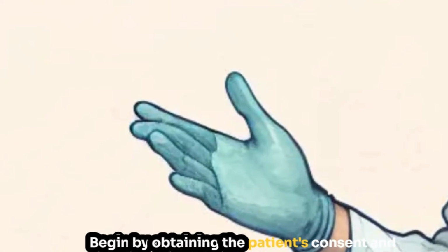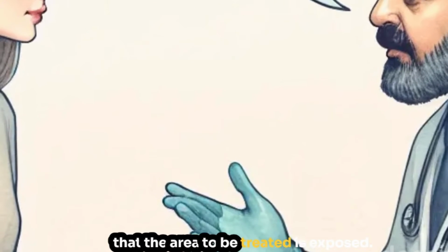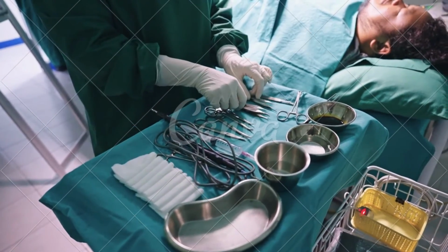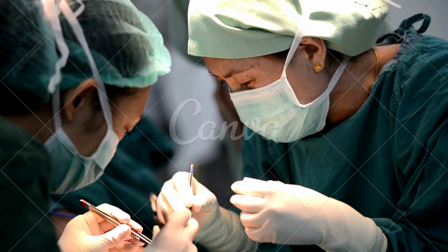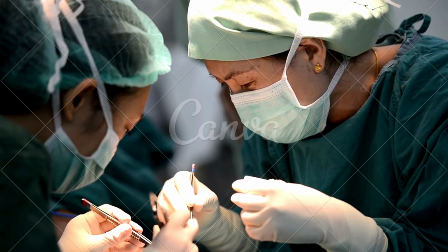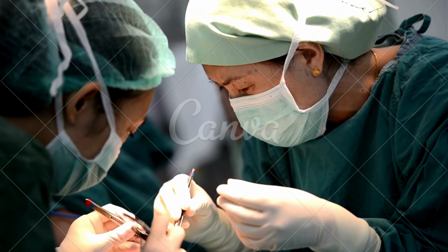Begin by obtaining the patient's consent and clearly explaining the procedure to them. Make sure the patient is comfortable and that the area to be treated is exposed. Clean the skin thoroughly and lay down sterile drapes. Administer local anesthesia carefully, injecting slowly and aspirating to avoid blood vessels. Then make an incision with the scalpel over the most fluctuant area, ensuring it's large enough for adequate drainage and ideally along skin tension lines.